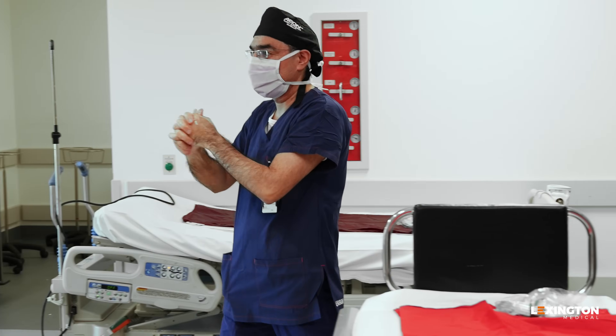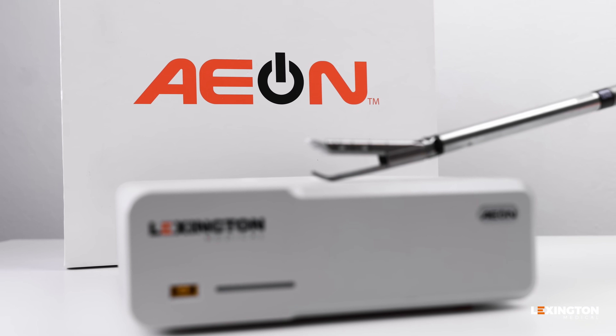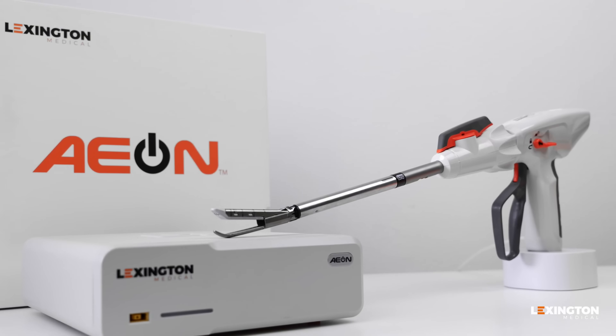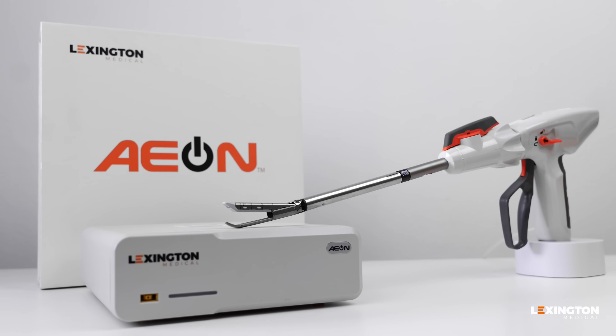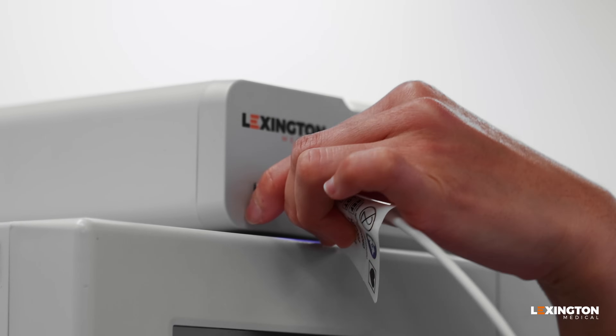When precision matters most, surgeons around the world trust the Aeon Powered Stapling System, proudly designed and manufactured in the USA. The Aeon Powered Stapling System is easy to set up for the surgical team: turn on the control unit, plug the stapler in, and the system is ready.